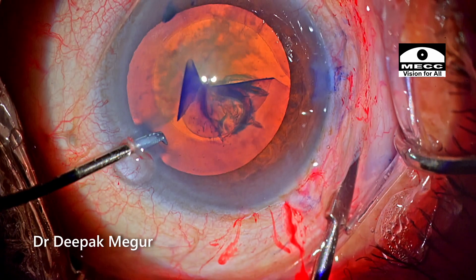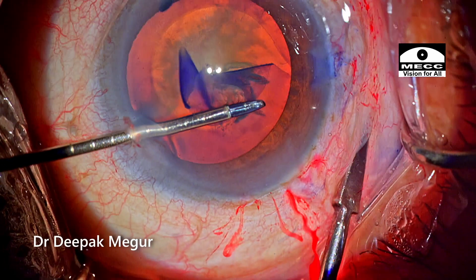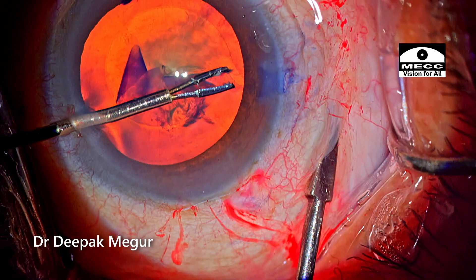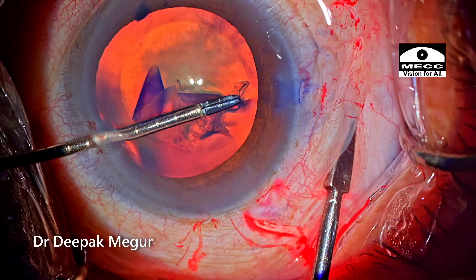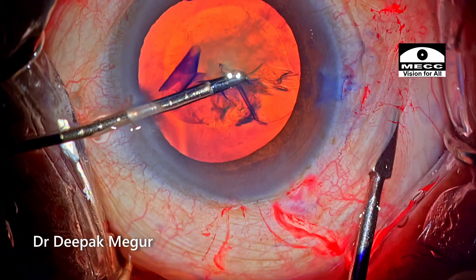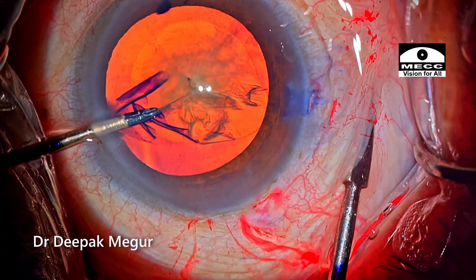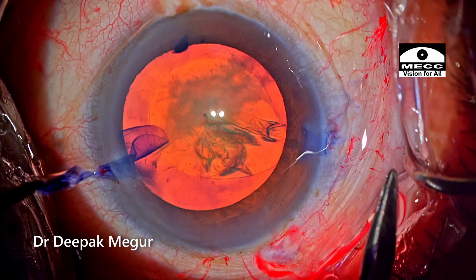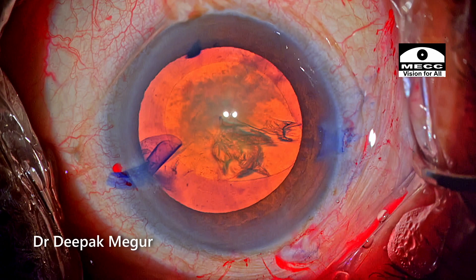I'm going to introduce the forceps through the opposite side port so that the angle of attack is quite appropriate, and at the same time the scleral depression is going on. Now I grasp the flap and pull it centrally repeatedly, and it comes quite easily. Of course this was possible even without scleral depression, but this is something I tried and it seemed to work reasonably well.